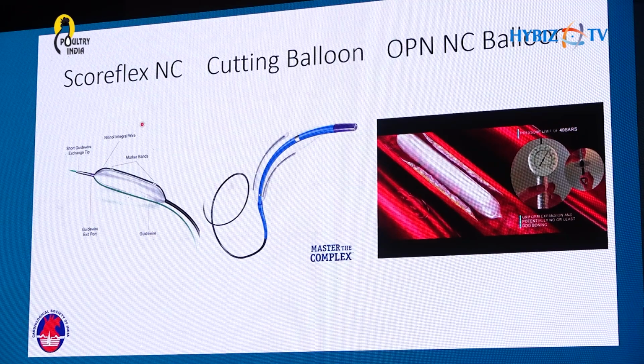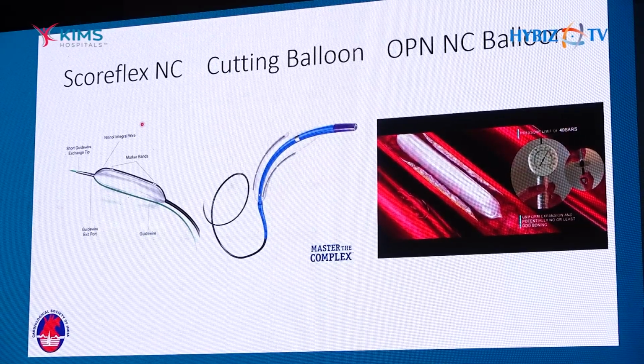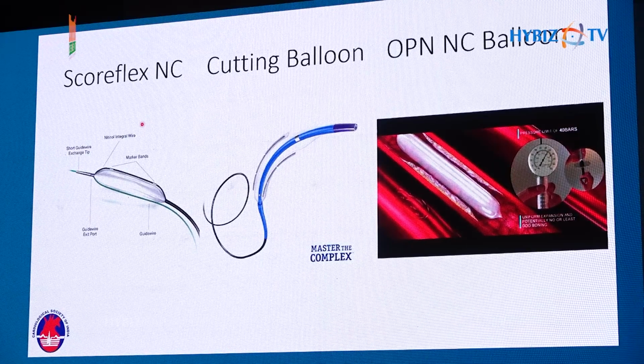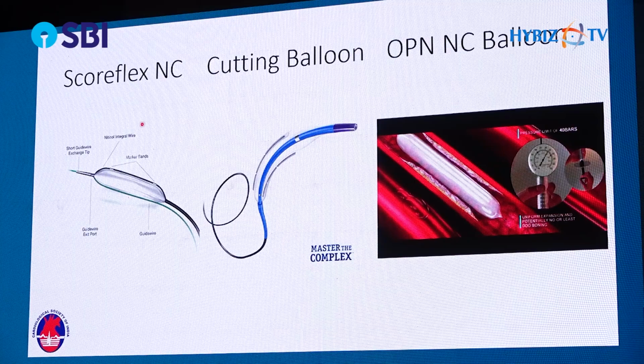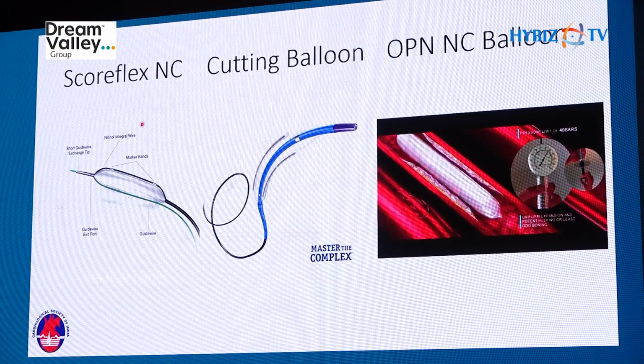I have some experience with a very bad lesion at the origin of the LAD crossing into the left main. A classical nodule, a very big, very thick nodule. I could not show that case here. I opened it only with the cutting balloon because it was so tight. It was not going to work with anything else. The cutting balloon worked here. So there is no fear that if we compress the nodule with high balloon pressure it will go to the other side. With the cutting balloon, that doesn't happen. Either it will cut or it will not be effective.